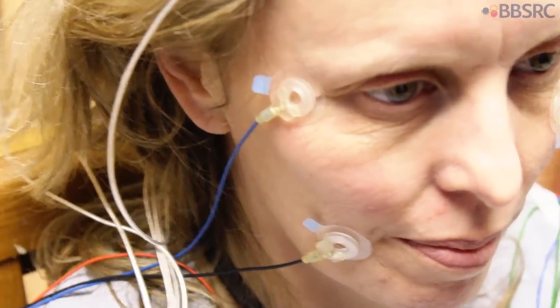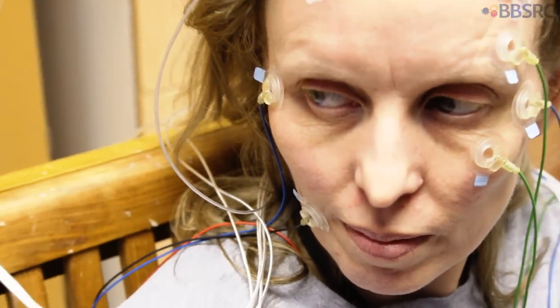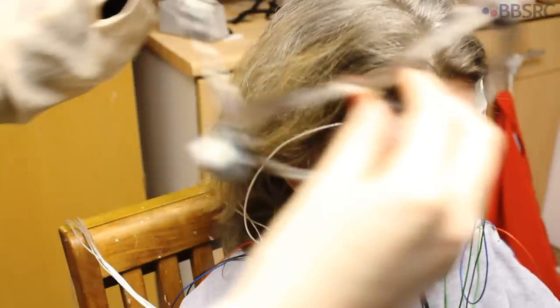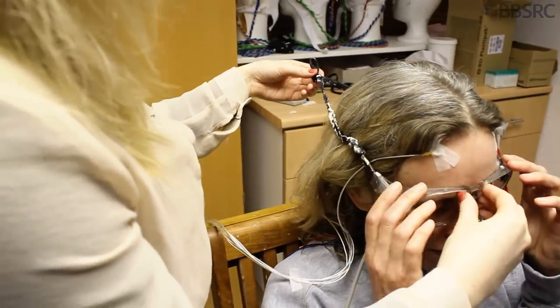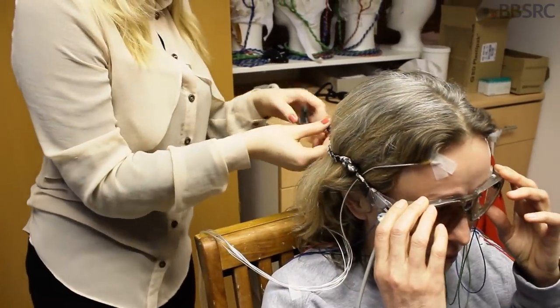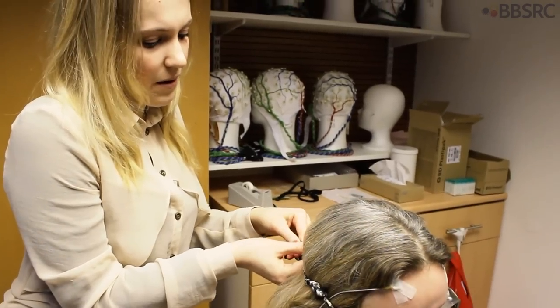Next I'm going to put on these glasses. These will give us a starting point for when I digitize your head shape. Hold them to your face until they're comfortable, then I'll tighten them up. Is that okay? Yeah, there might be a little bit of pressure.